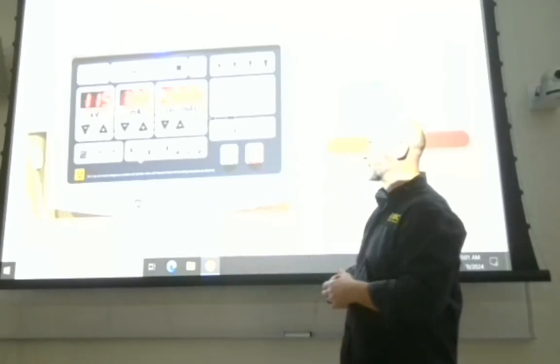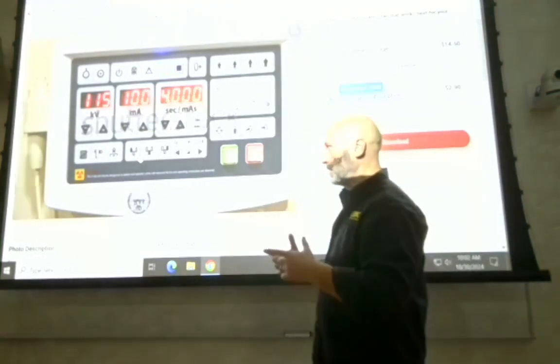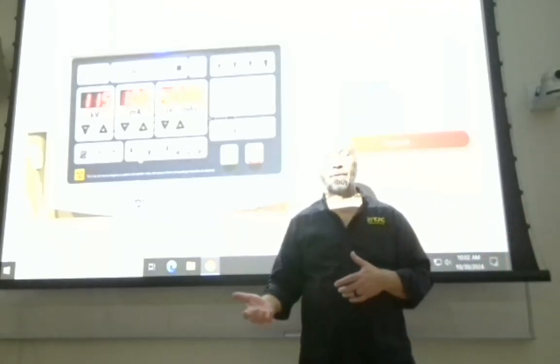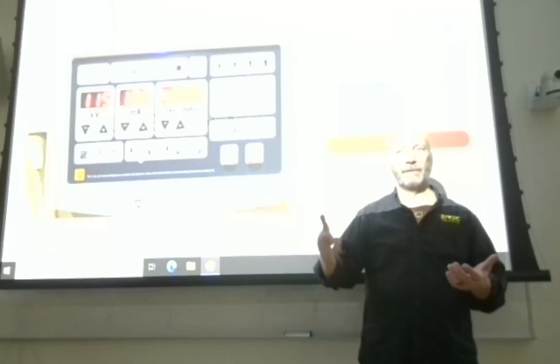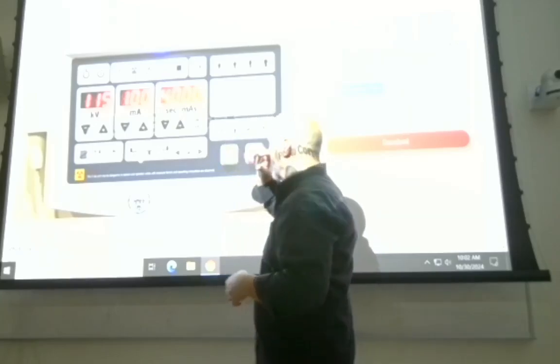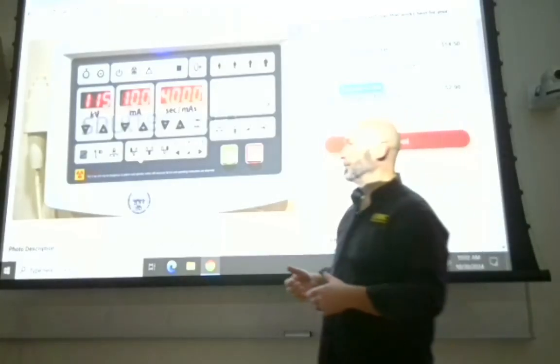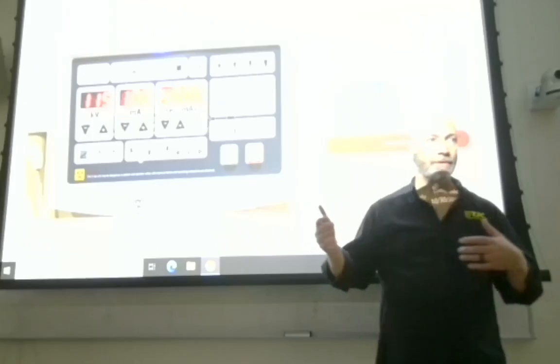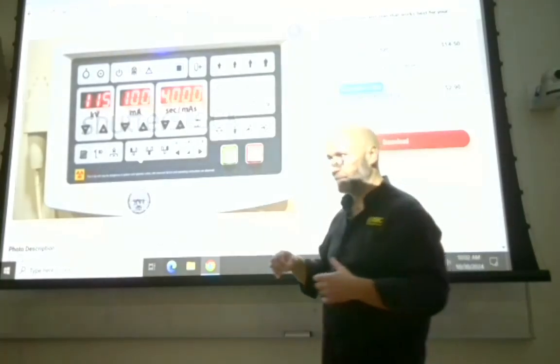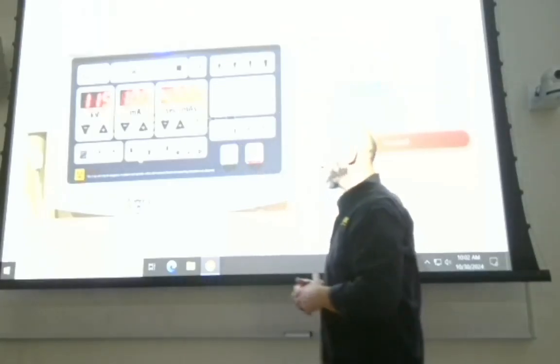But we've got a lot of other things to consider in a control panel as well. Your control panel looks a whole lot more complicated than this, but at the same time, it's simpler. You push a button for chest X-ray, you push a button for abdomen or whatever. So on a control panel like this, we have to set all that stuff. Okay, so we're going to talk about some things here, and it's not going to follow the same order as the chapter. So I'll try to kind of draw it all back in towards the end of the lecture.